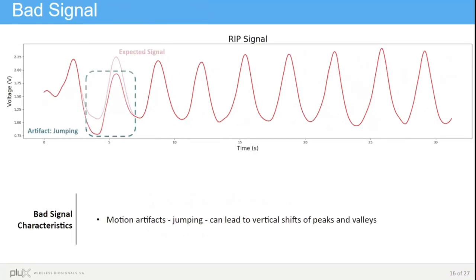Here is an example of a bad quality signal. In this case, we have a motion artifact from jumping, as we can see in the plot in the blue border. The second peak has a vertical shift, the valley is much earlier, and the peak is much lower as well compared to the expected signal.